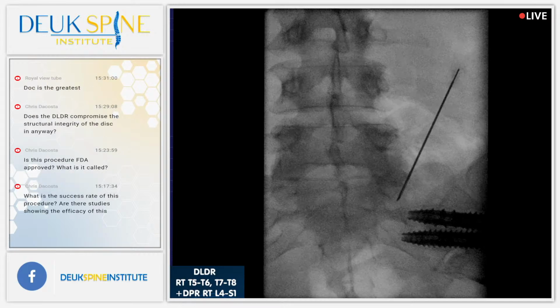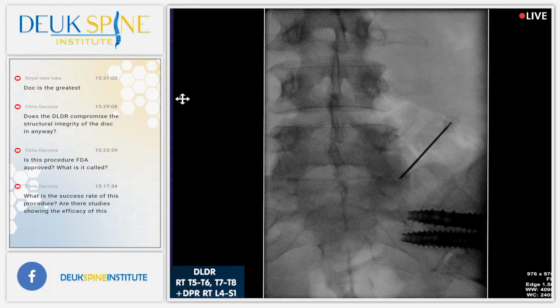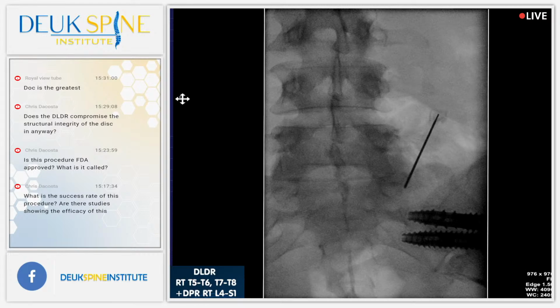Shot. Too low. Shot. Shot. Getting closer. We're going to shoot a chest x-ray and auscultate once we can get to the lung fields better. Standard. Are you concerned? Not at all, but you're asking me about the lung fields. Absolutely. I cannot access them. Right now our sats are 99. All right. Yeah, because the drape is too high. Not the front though, you can't? Through the front, the chest? She's in the prone position. Not as reliable.